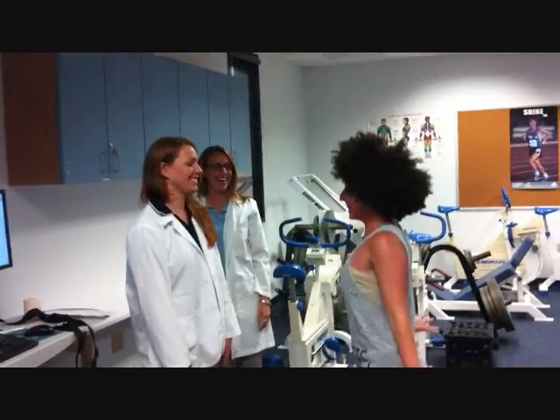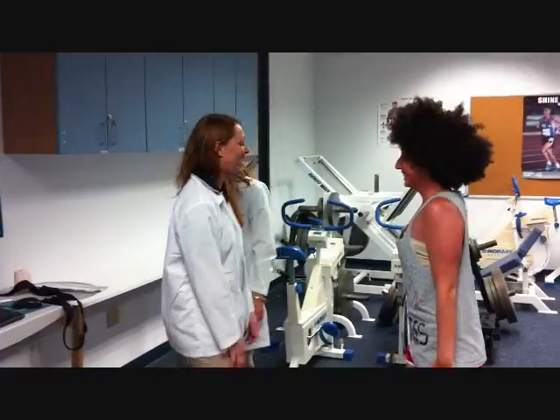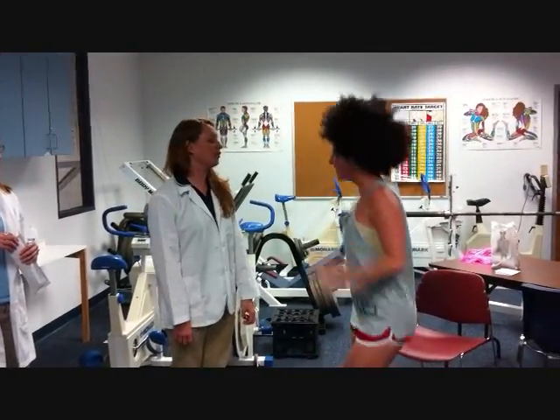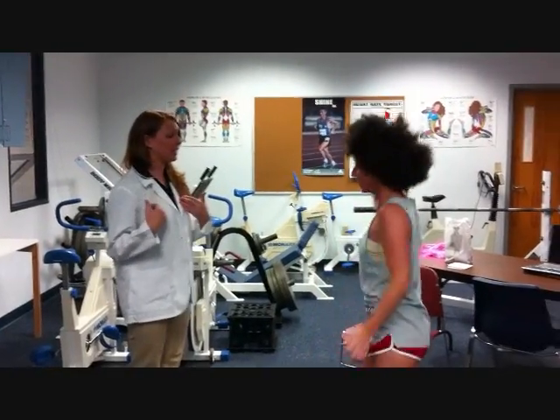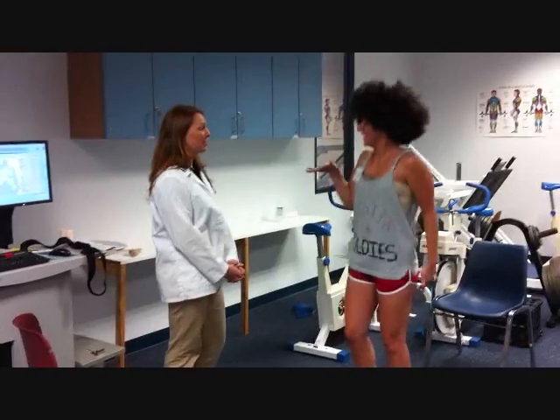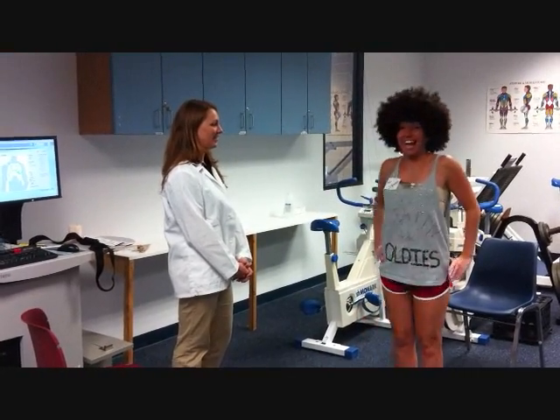Fabulous! Okay, we're going to get a measurement of your heart today using the electrocardiogram. So first what we're going to have you do is place the leads on your chest in order to get a correct measurement. Okay, we're started right now. Sound okay? That sounds fantastic!